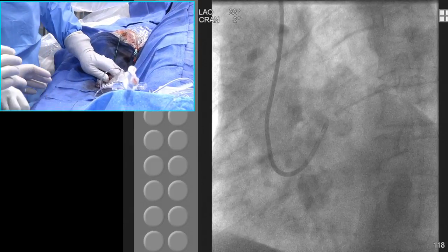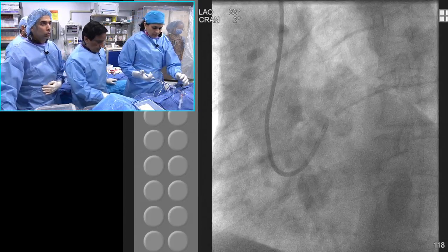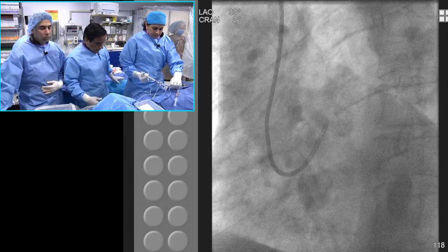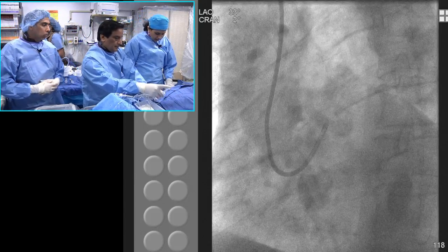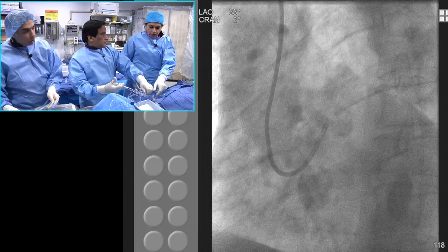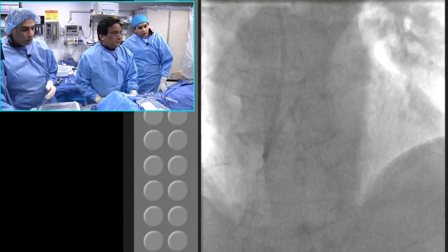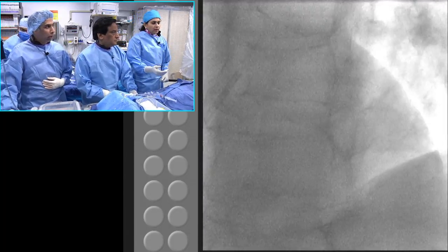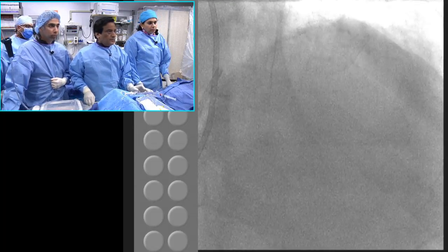Beautiful. Anu, if this was a heavily calcified bifurcating lesion and you needed rotational ablation, do you think it is as easy through radial access? No, I think once you get the guide in, it's not an issue. It is easy, but with a rota here, we have this extended board. Sometimes we feel that getting those devices right here could be some issue, but otherwise no problem. I think also, particularly with the mother-daughter catheter systems, some of those tougher cases have become more doable. Yes, you can use those.